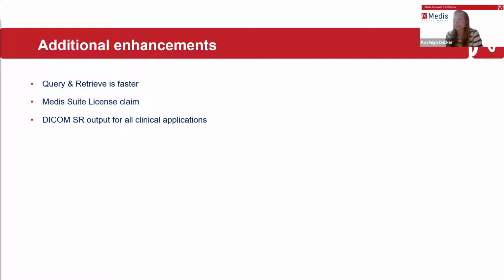And then the last one, which is also a very interesting one, is that now for all clinical applications, the output is also available in DICOM-SR. It sounds a bit techy, but what it actually means is that DICOM-SR is an output format that your own reporting system can listen to.